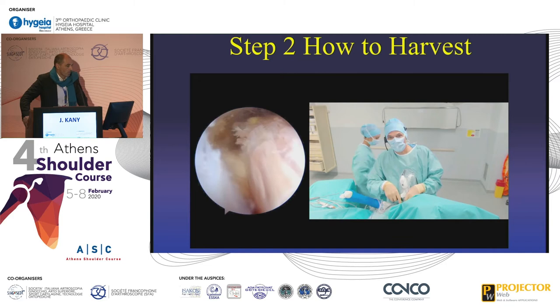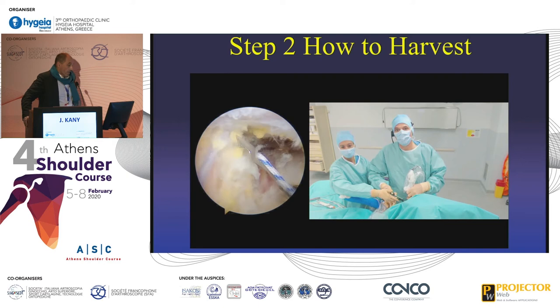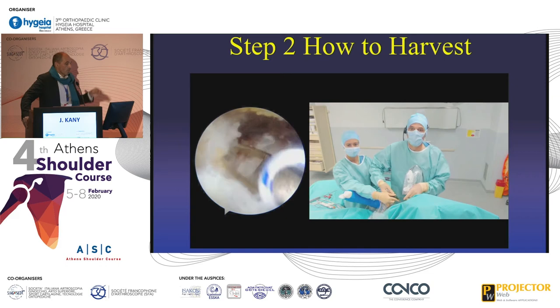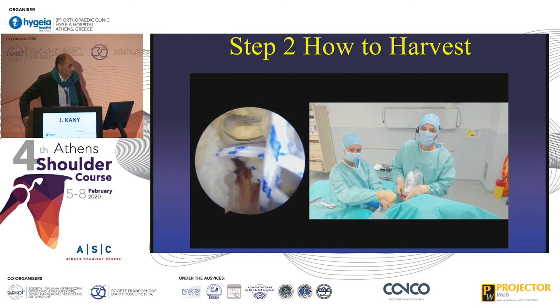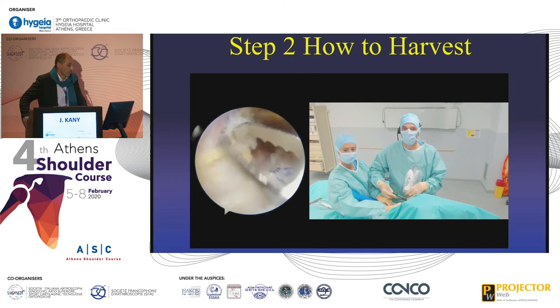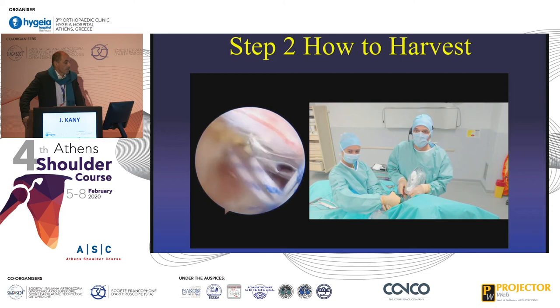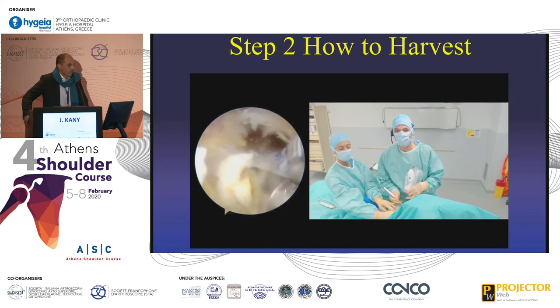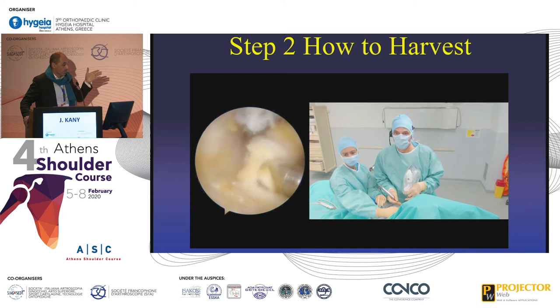Regarding the portals — when you make a tenodesis of the biceps into its groove, as I showed two days ago, it is exactly the same portal. You see the pec major, we are under the pec major, and on the left you can see the subscap. The white is the lat dorsi, the red is the teres major, and you can see how bulky the teres major is. You can see the needle, with the subscap just above. And this is my second triple Krackow suture — the green one at the distal edge of the lat dorsi, and the blue one at the upper part of both the lat dorsi and the teres major.